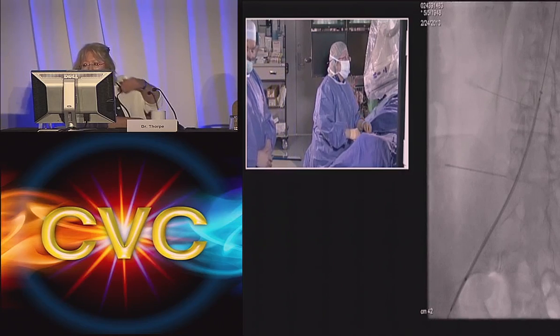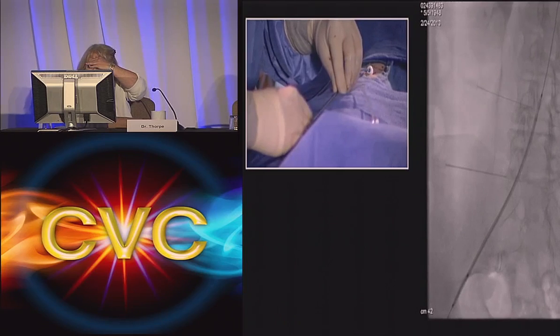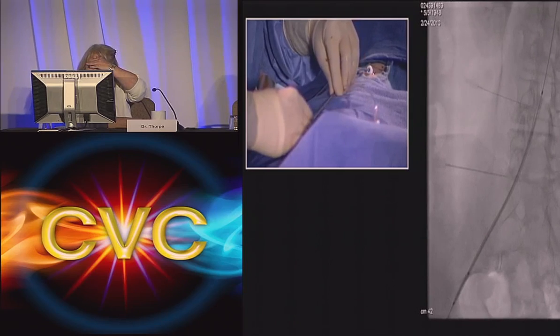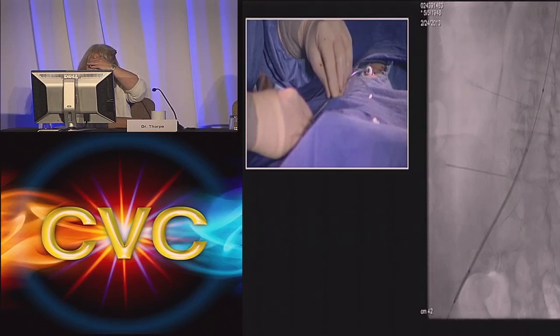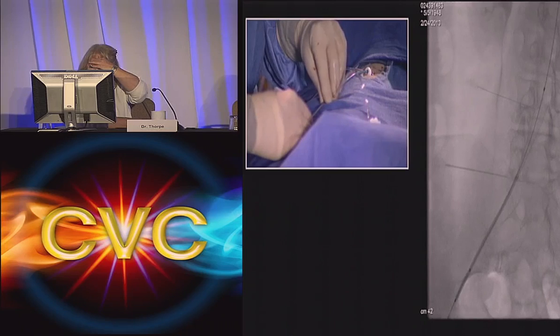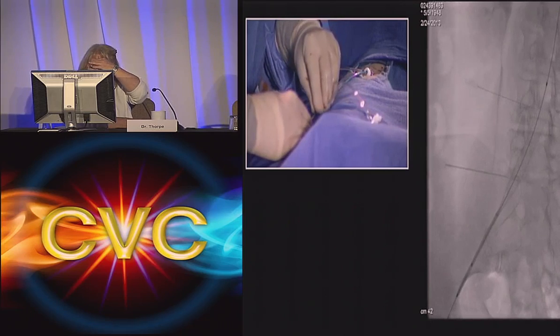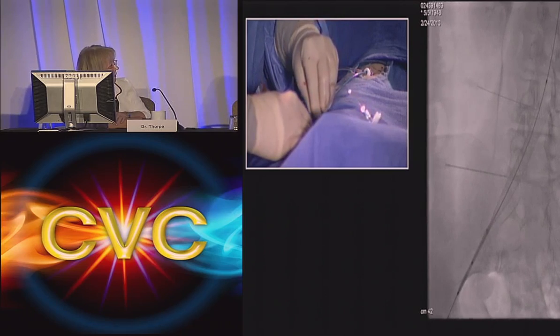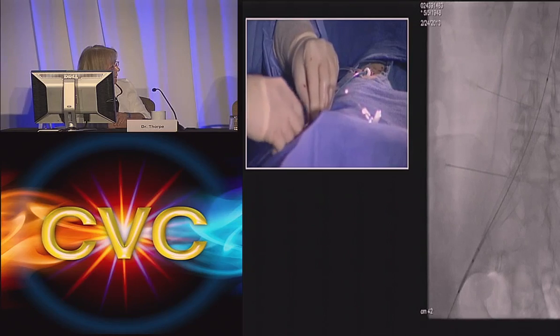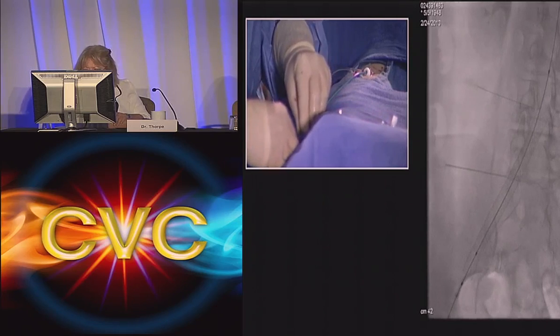Okay, now watch this. We have some needles in place as well. This is a 16 stent, so as it opens, we'll see it flare. And we want it just up into the cava a little bit, not too far. I'll pull it back down where we're just by the bifurcation, and we'll extend it down into the external iliac, and I'll hopefully have good apposition with all the walls. And so now it's deployed.